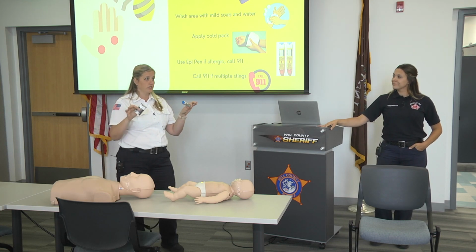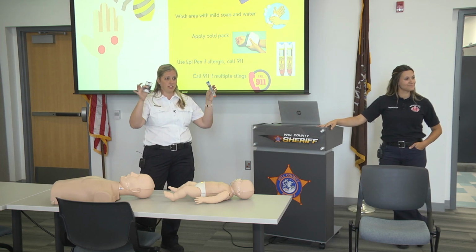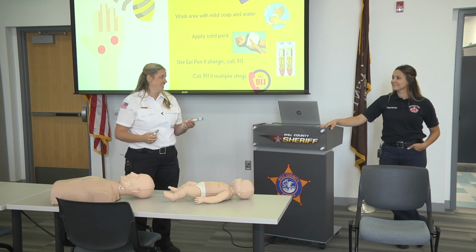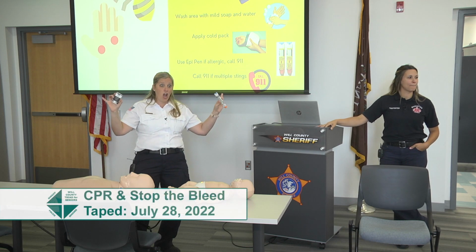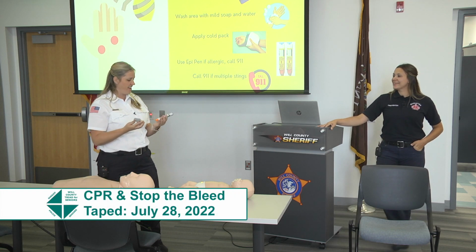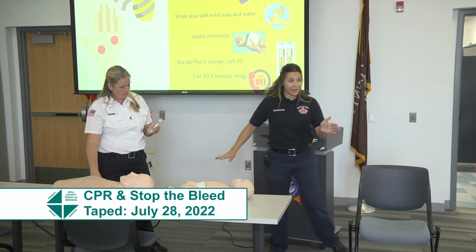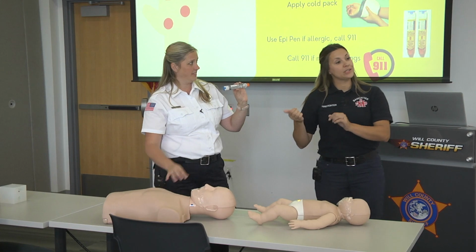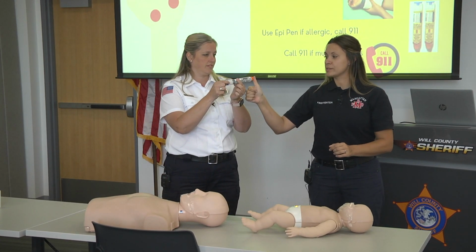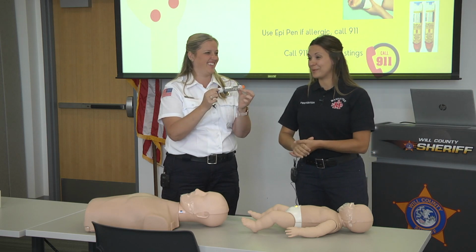So when I show you how to use it in a minute, I'm not putting a real needle with drugs into my skin. I promise you it's just a trainer. I've scared people that way when I forgot to mention it was a trainer. They're thinking, no, what did she just do to herself, right? And it is important that you do follow directions, because unfortunately there have been situations where people don't follow the directions, and when they go to inject the EpiPen, they push the wrong side and it actually injects them in the thumb. So we don't want that to happen, just a heads up.